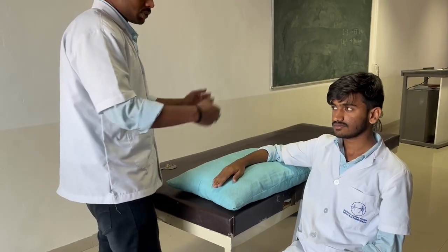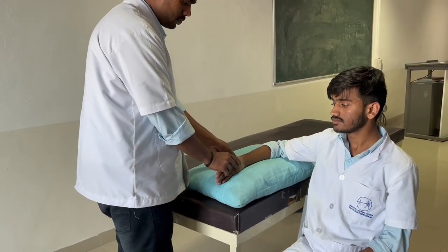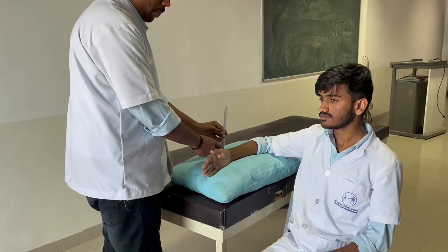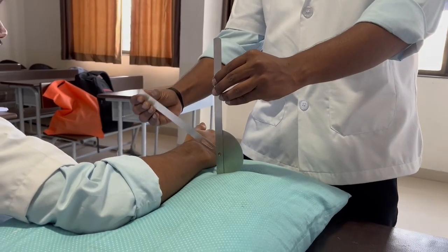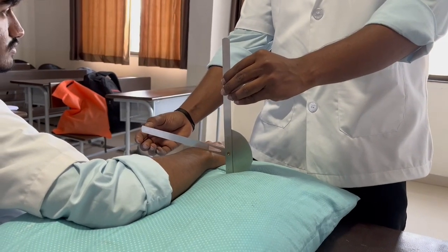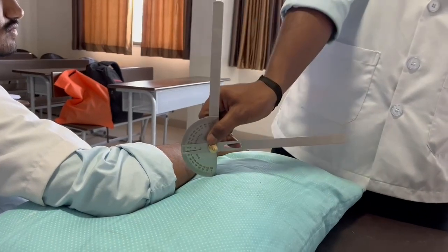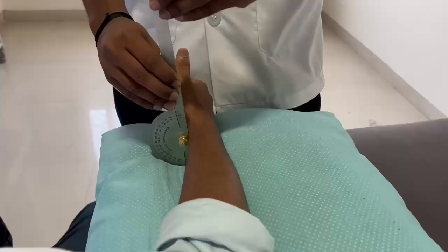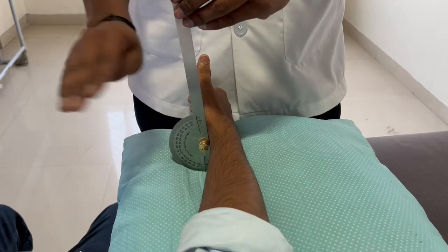Next, we'll be seeing pronation. The subject position should be sitting, with the shoulder at zero degree flexion and extension. The fulcrum should be placed lateral to the ulnar styloid. The movable arm should be across the dorsal aspect of the forearm, and the stable arm should be parallel to the anterior midline. The normal range for pronation is 90 degrees.